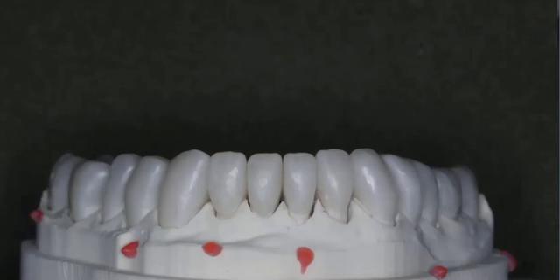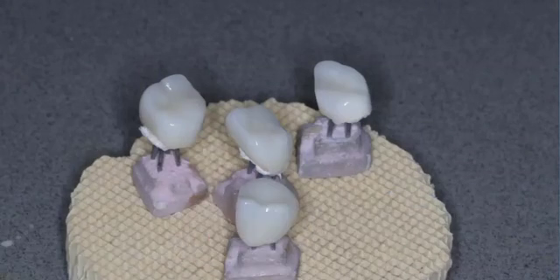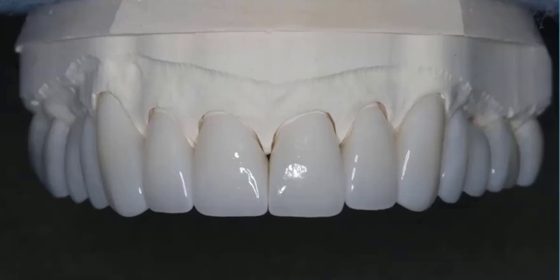It's lower. Keep going. Staining, glaze. Okay, and glazed up, and that's what we end up with.